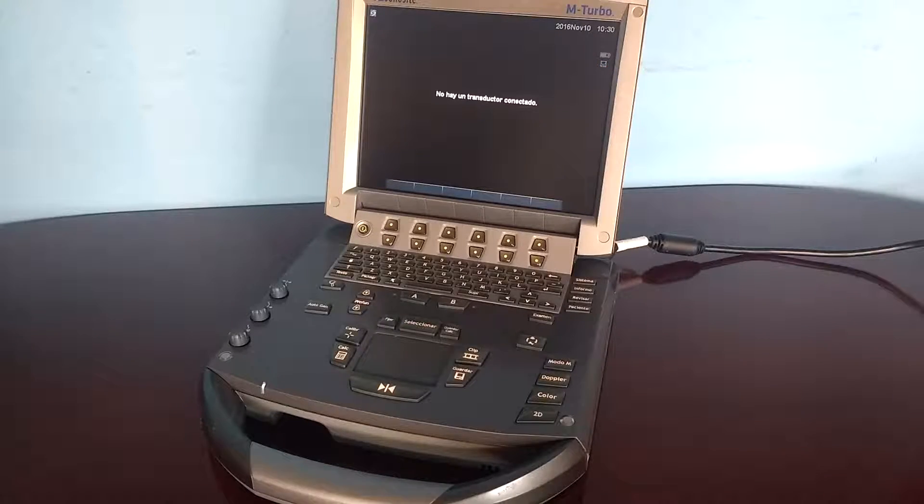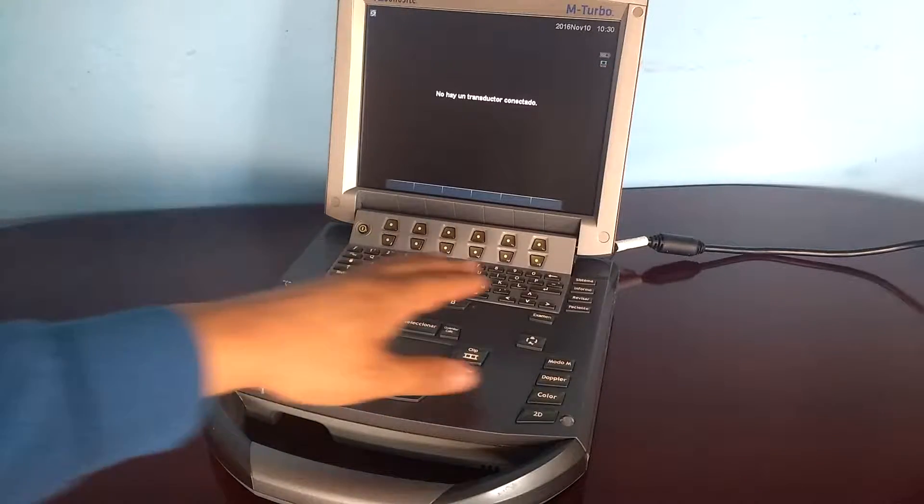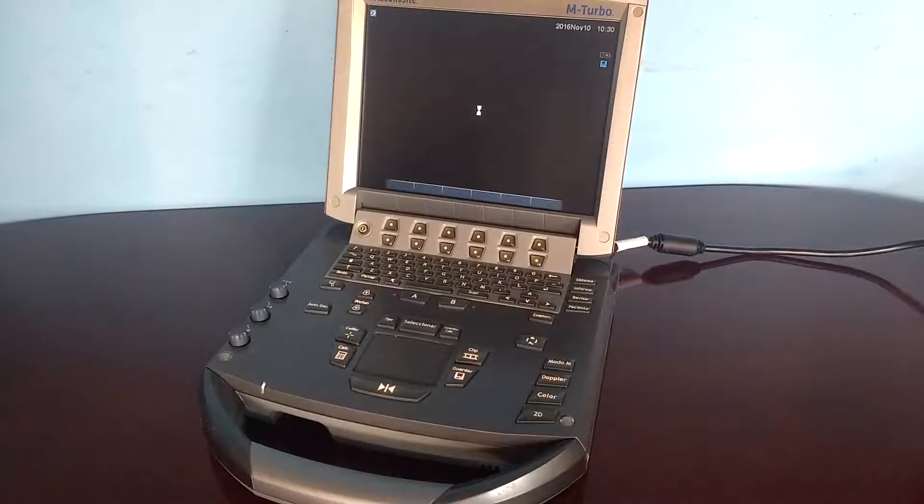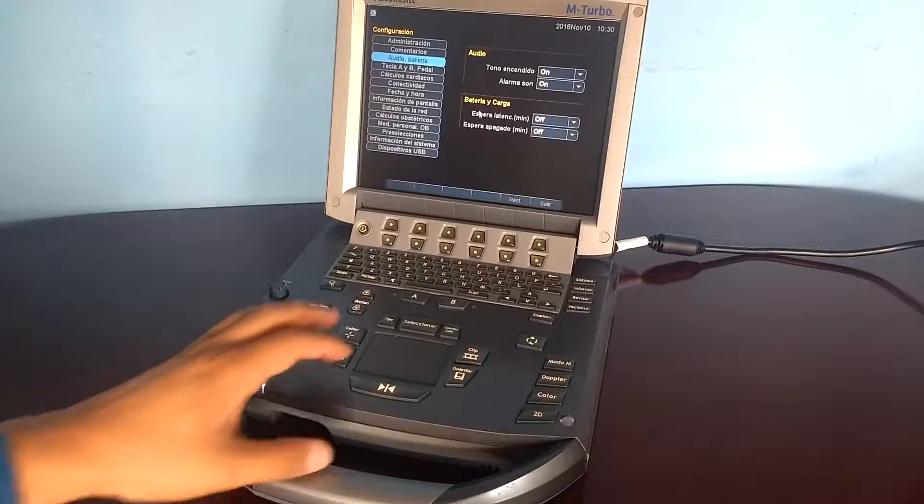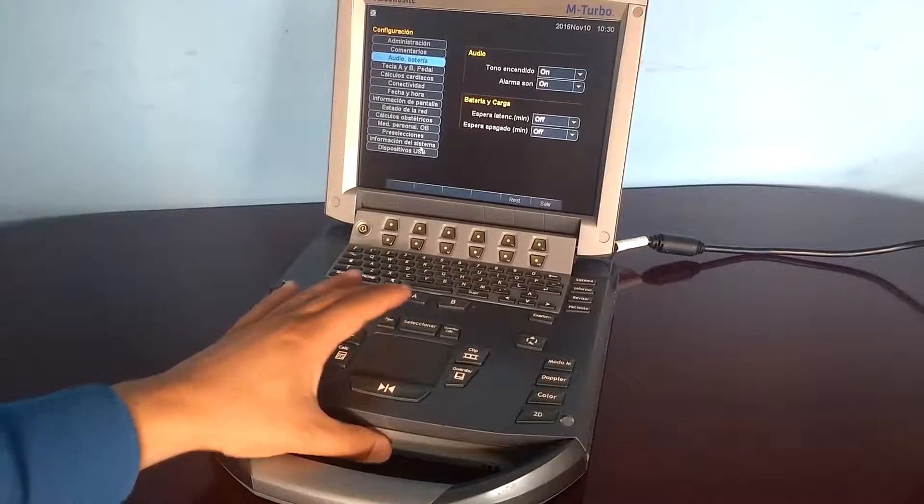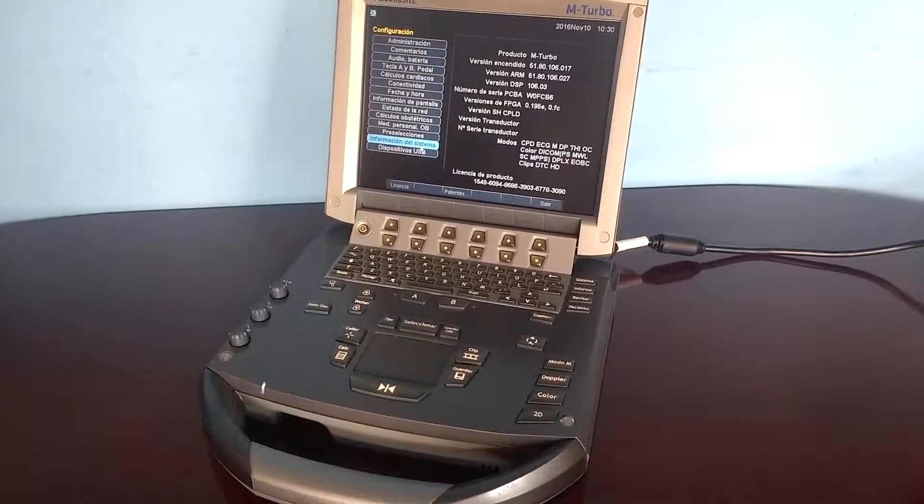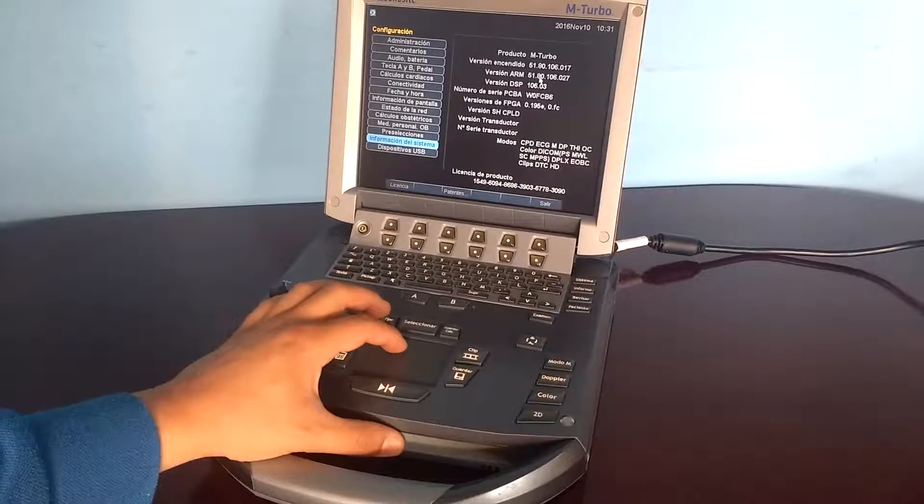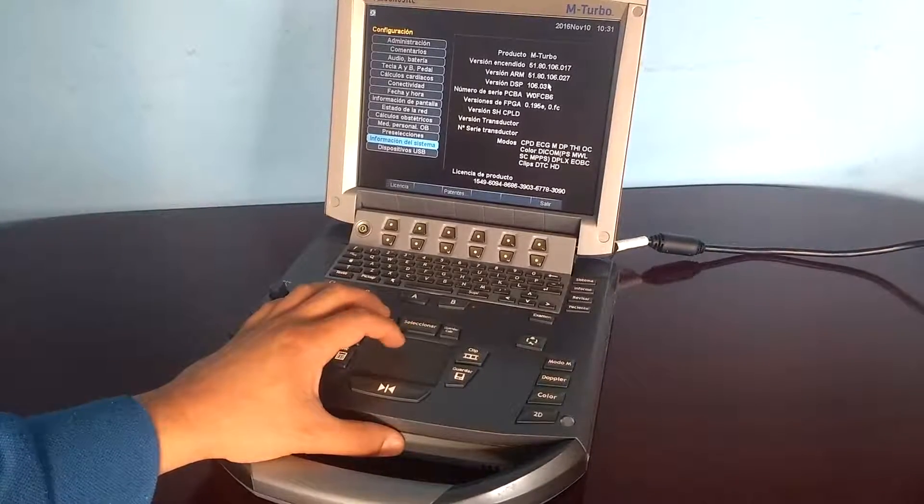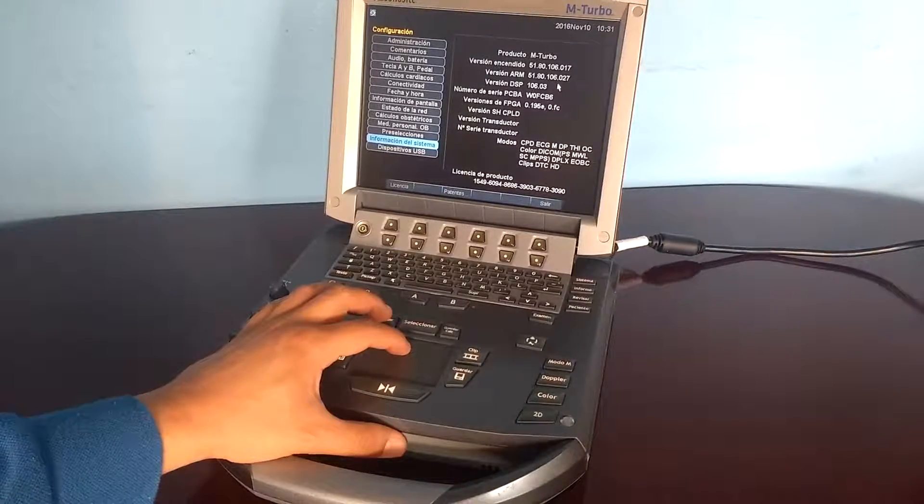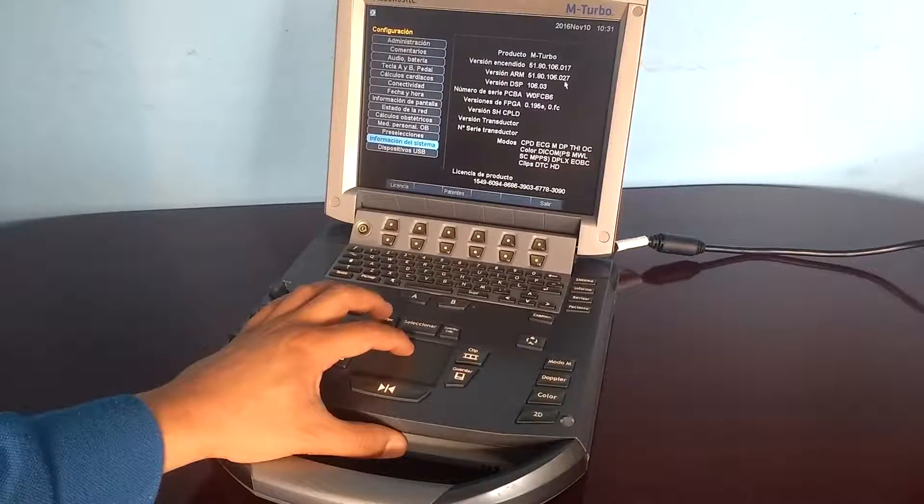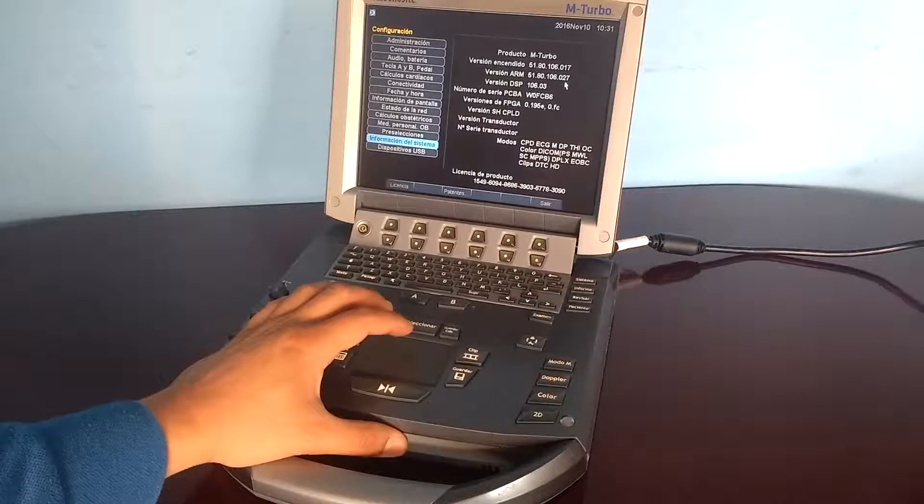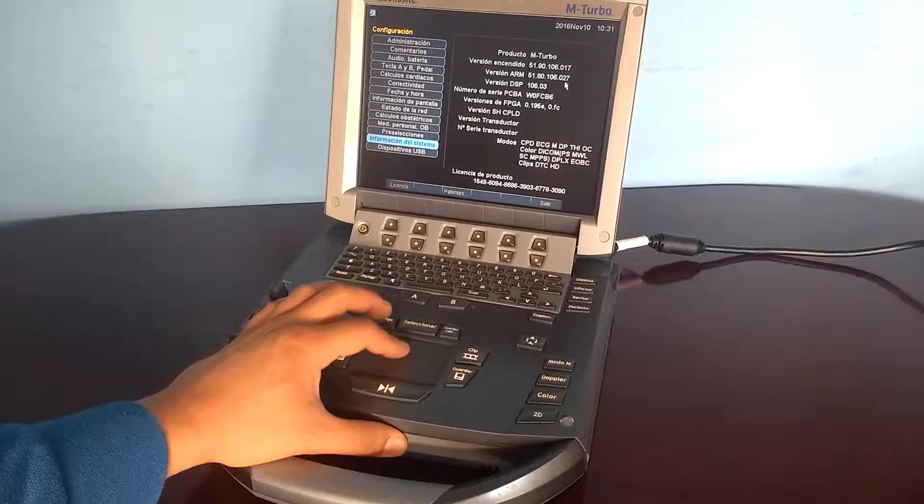Verify the current version by pressing the system key. Then click on system information. There you will see the boot version and the ARM version. This will be the current software version.